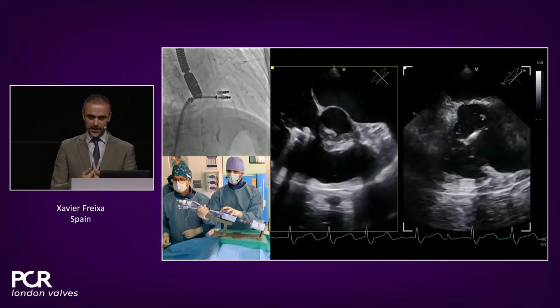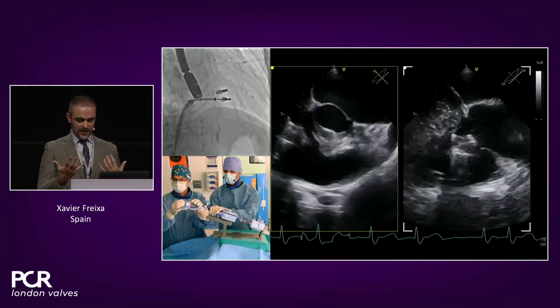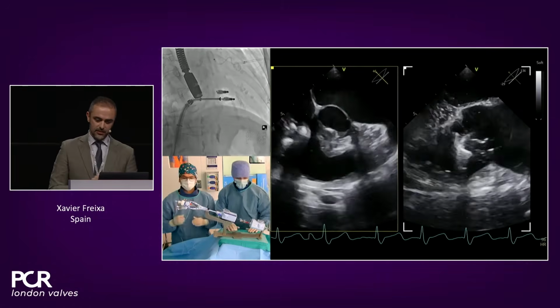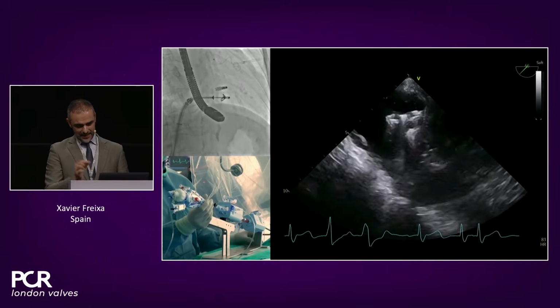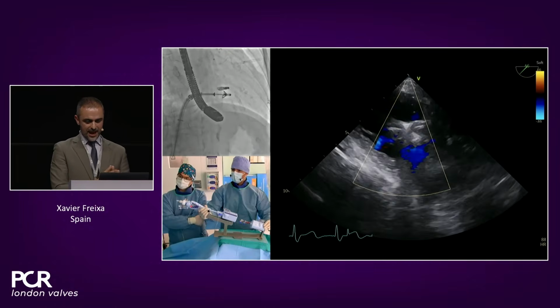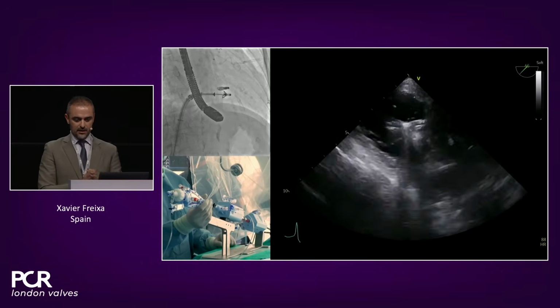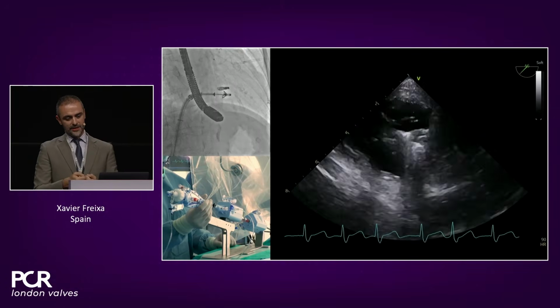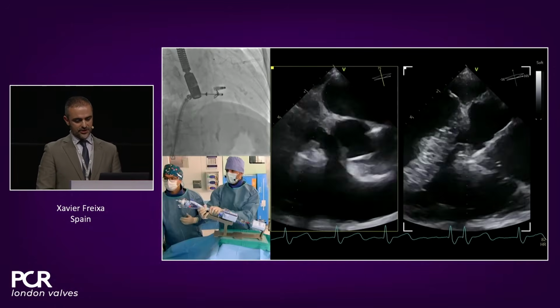Maybe now it's not so real, but that patient had a large gap. So in this case, we advance. We check that the orientation was good. When we have a clip, we like to advance with the clip closed. And here you'll see that probably we need some tiny clockwise turn, because it's not, I would say, the lateral arm. It's between the posterior and the commissure. So we want to ensure that it's grasping a lot of posterior tissue or leaflet. And probably here it's too anterior. We're going to pull back a little bit from the stabilizer to get a more central position.